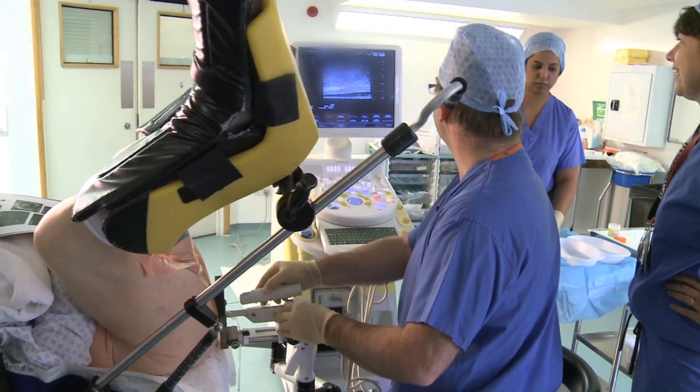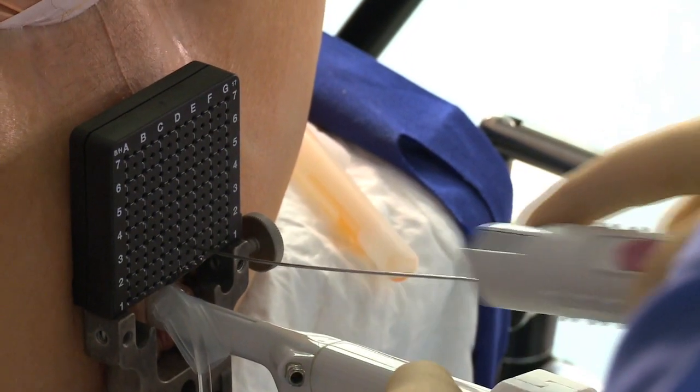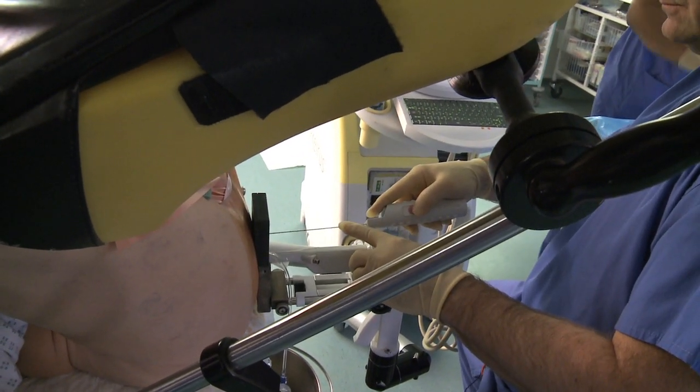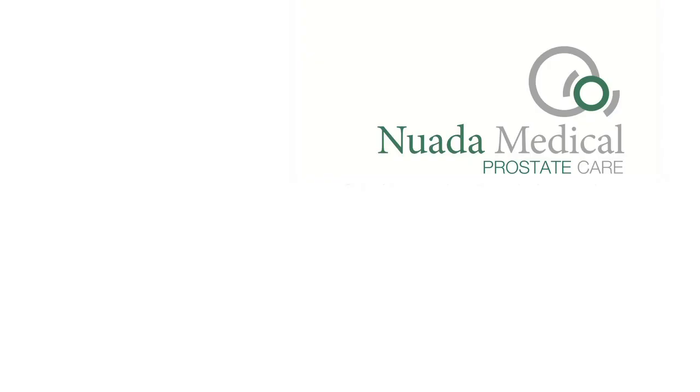Most urologists grew up doing transrectal ultrasound guided biopsies of the prostate, and they know how to use the probe. They just need a bit of direction, how to set it up with a brachytherapy grid, and to follow what are really quite clearly defined parameters in order to biopsy the prostate gland comprehensively.